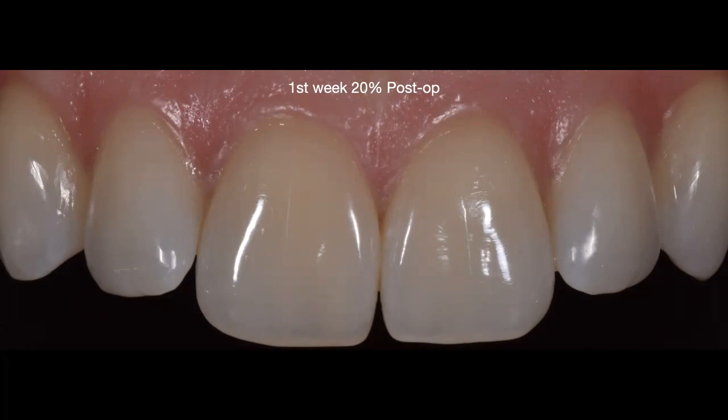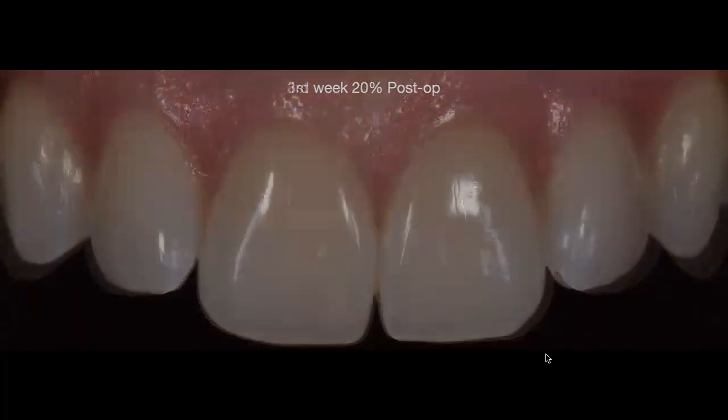The only thing that we told her is, place a portion of the bleaching gel, just a little dot on the incisal third or middle third of the tooth, and just seat it down. If you see any excess, just clean it with your fingers. So very easy for her. Very little product was being used. This is 1 week after 20%. And now you can see, with higher concentration, a little bit more improvement. And most importantly, we were now improving in the middle and gingival third of number 8. Slowly but surely we were progressing.